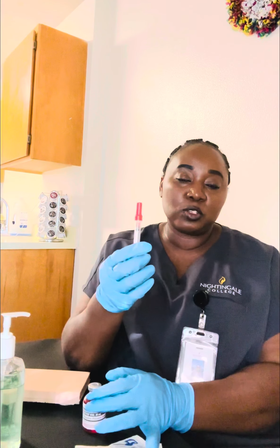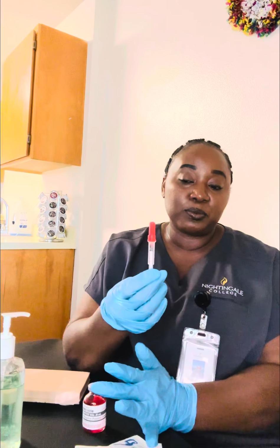If the patient is not with me when I draw up the insulin, I'll label it with the patient's name and the dosage on it before going to the patient's skin. Once I've done that, I will then place that down. I'm done with this one. Then I'll get the site of the administration.